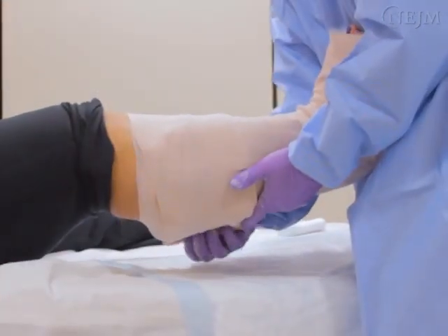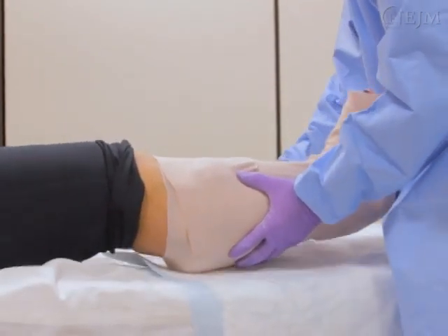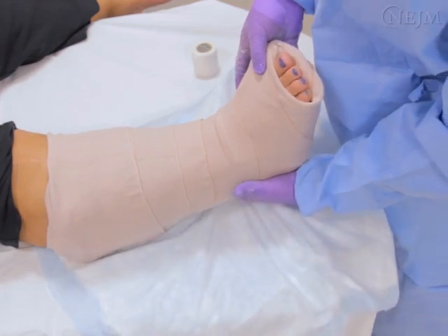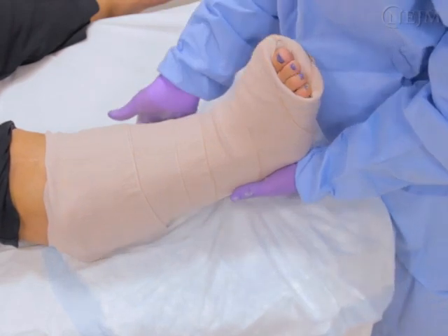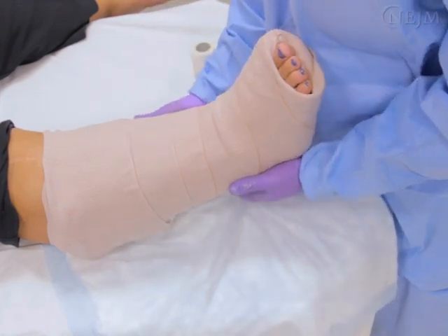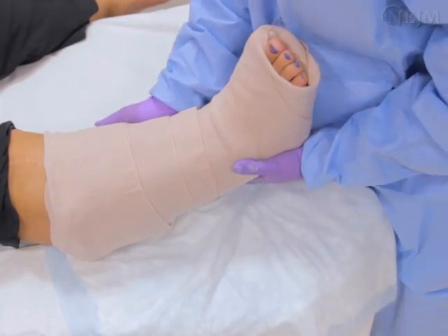Once the ankle is encased in the splinting material, gently mold the material to maintain the position. With one hand, apply gentle pressure around the distal calf just proximal to the injury. And with the other hand, cup the hind foot and apply gentle pressure to preserve the position until the plaster material hardens. Be sure to apply an even amount of pressure. Any uneven areas can lead to pressure sores.